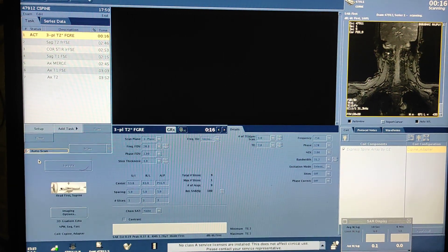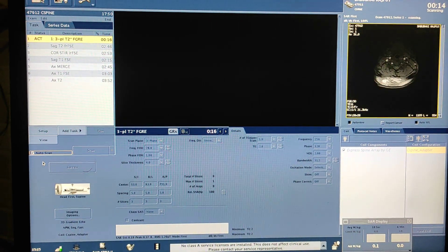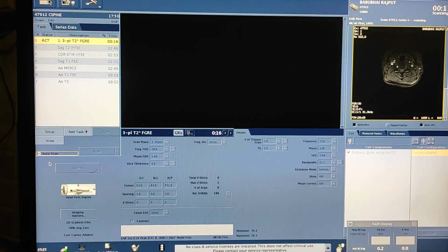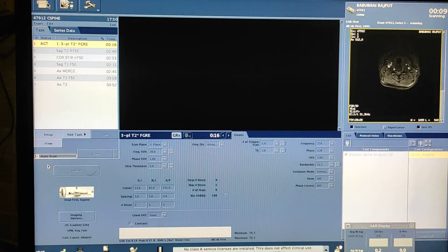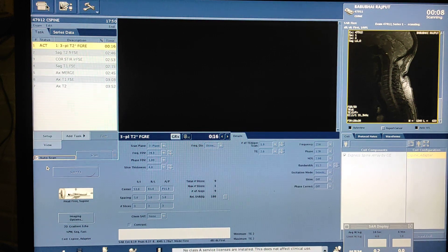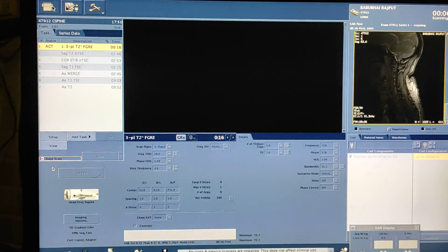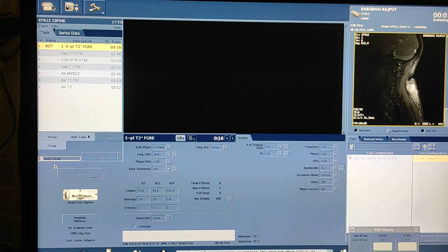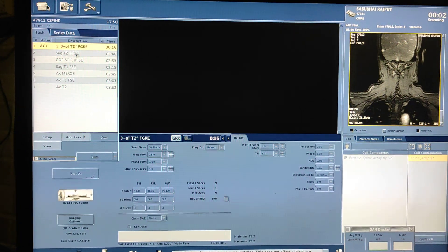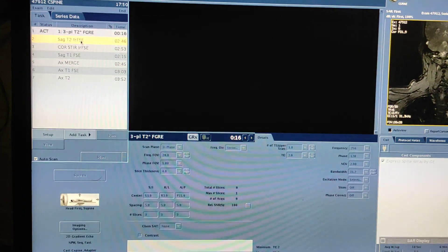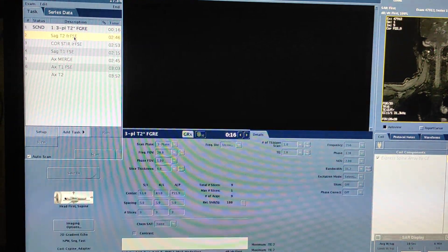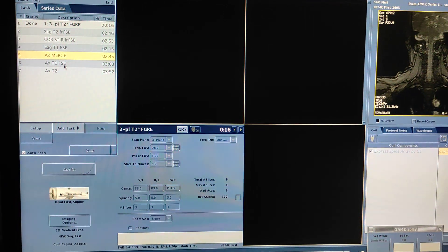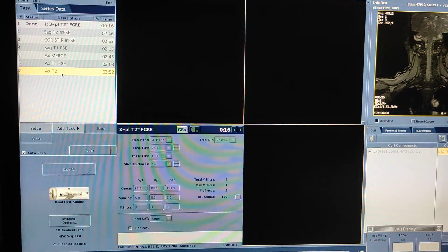First of all I will plan SAG T2, because if I get SAG T2 first, the rest of the sequences for axials and coronal I will plan on that SAG T2 sequence. The protocol is: SAG T2, SAG T1, coronal STIR, axial MERGE (which means axial gradient), axial T1, and axial T2.